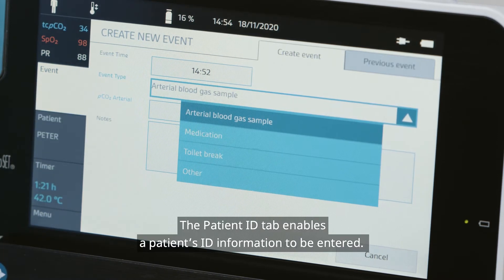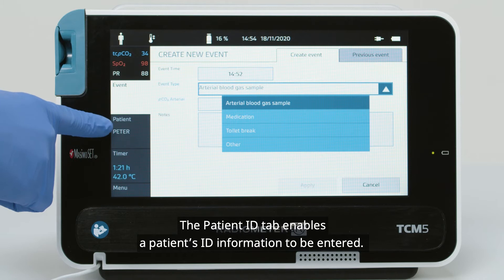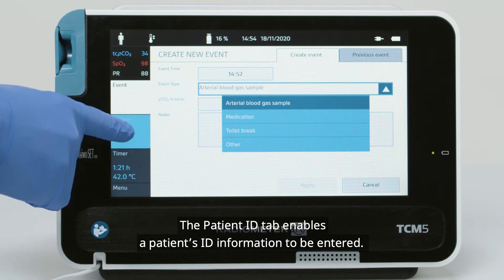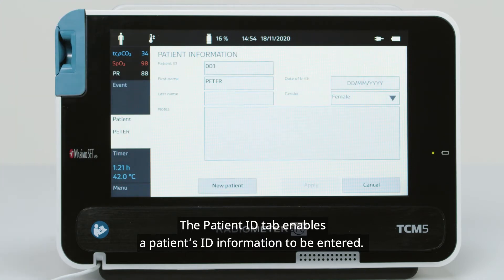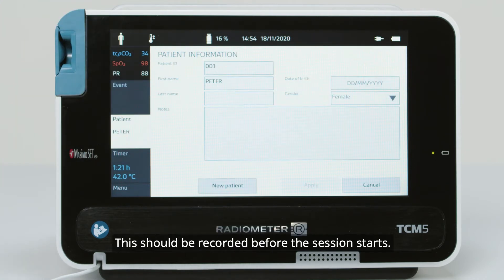The Patient ID tab enables a patient's ID information to be entered. This should be recorded before the session starts.